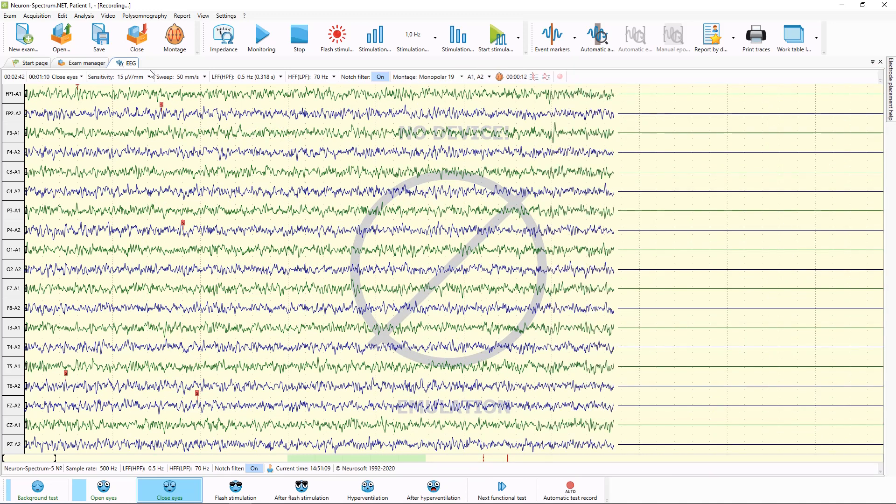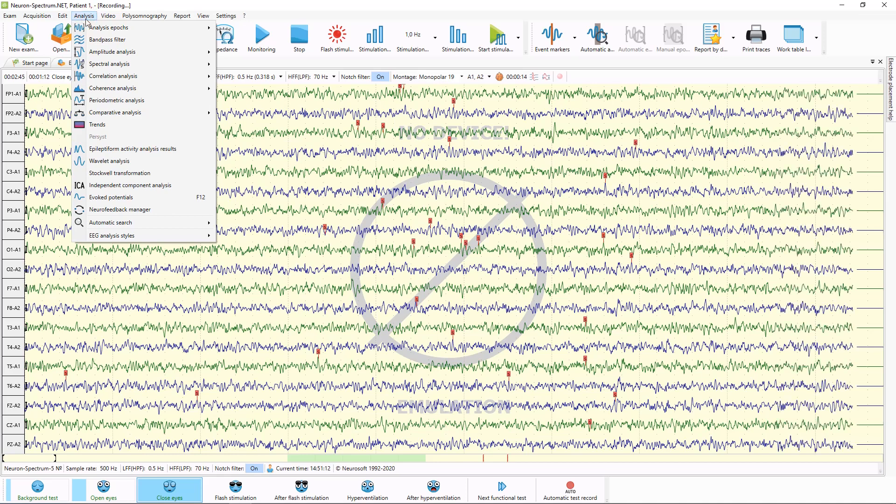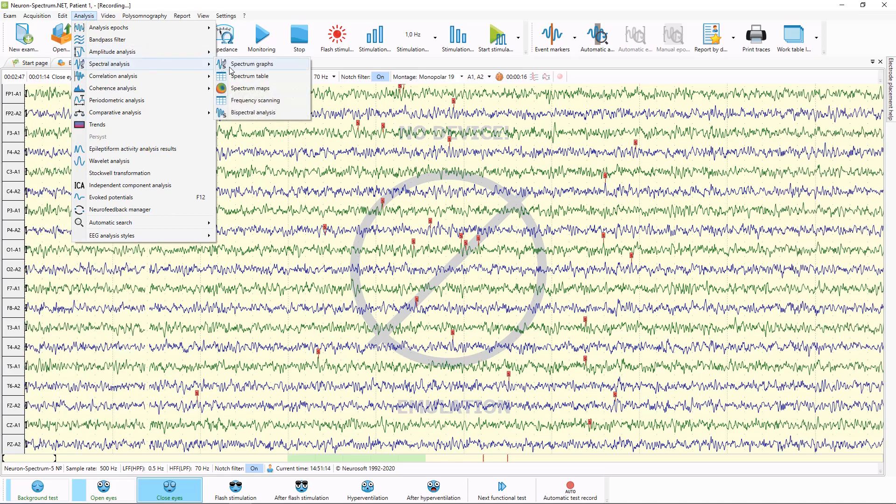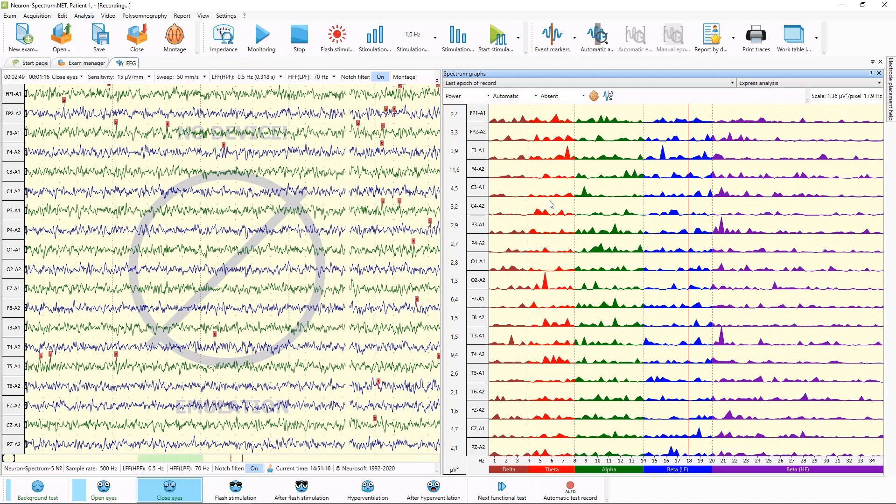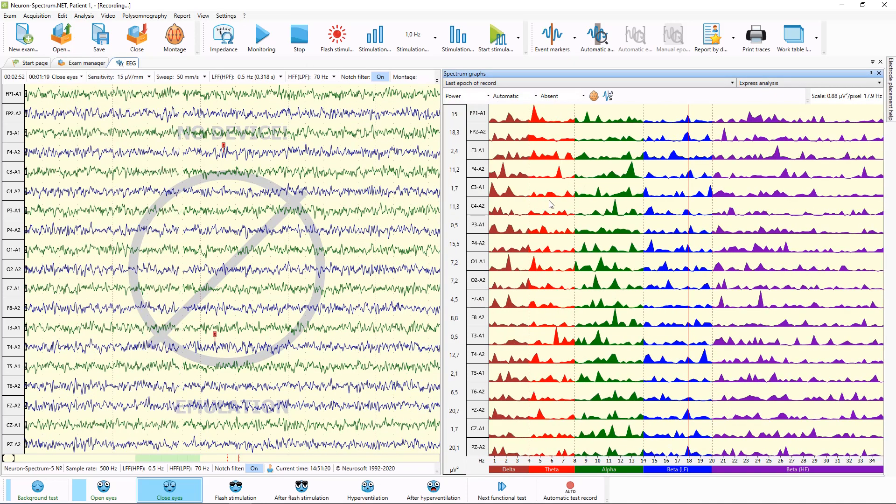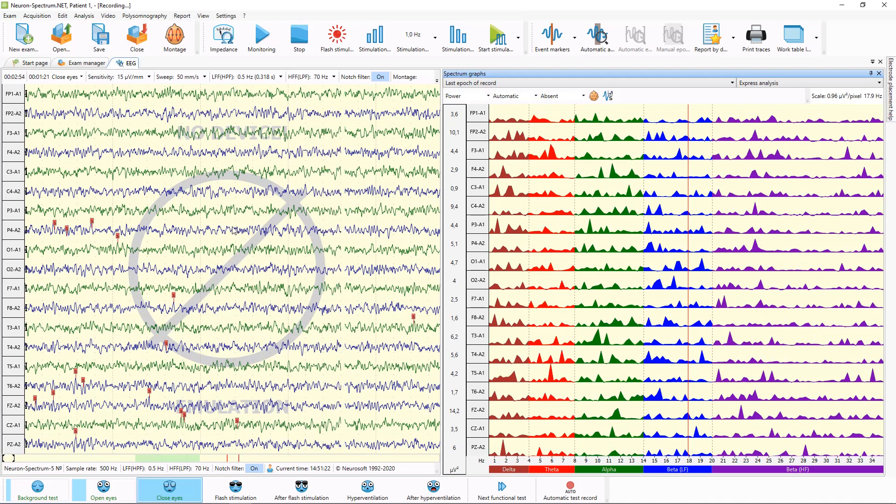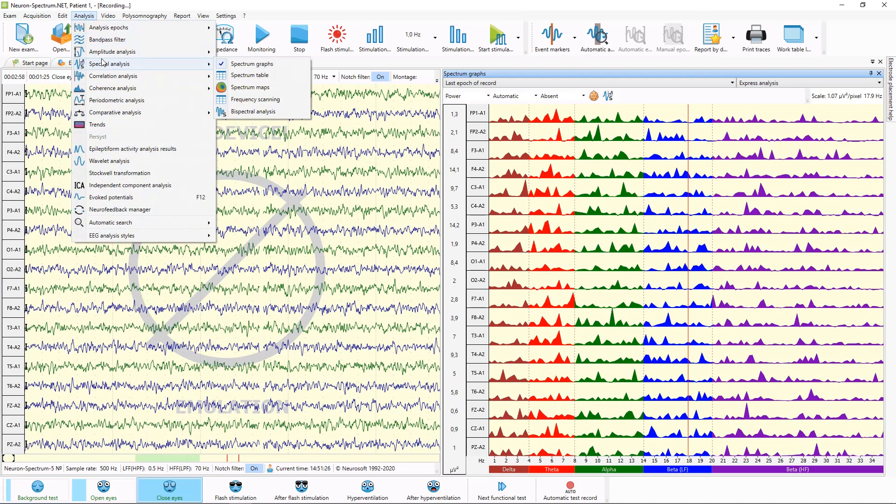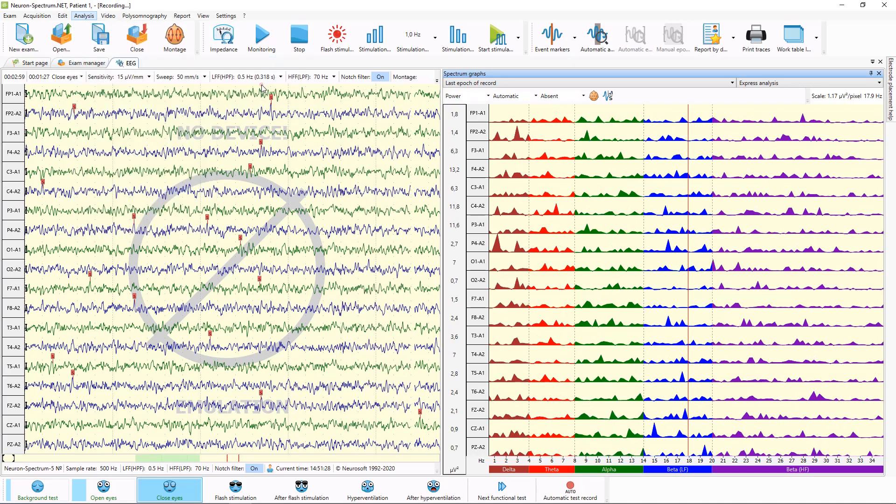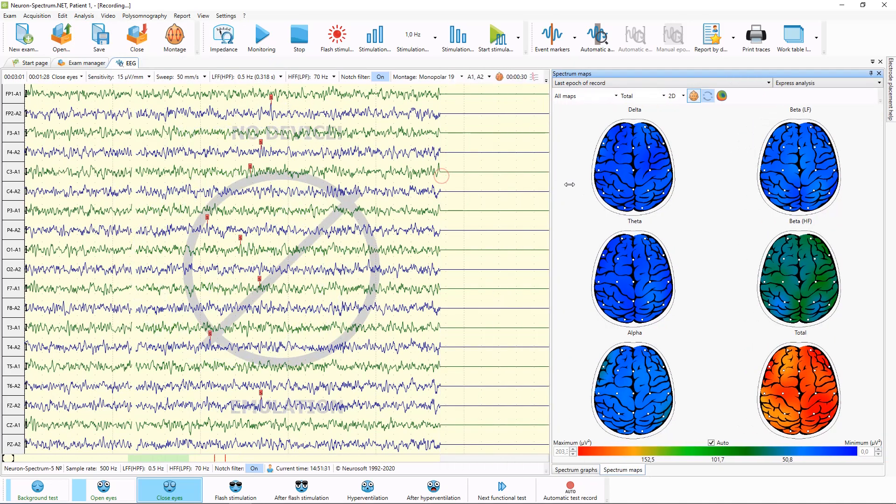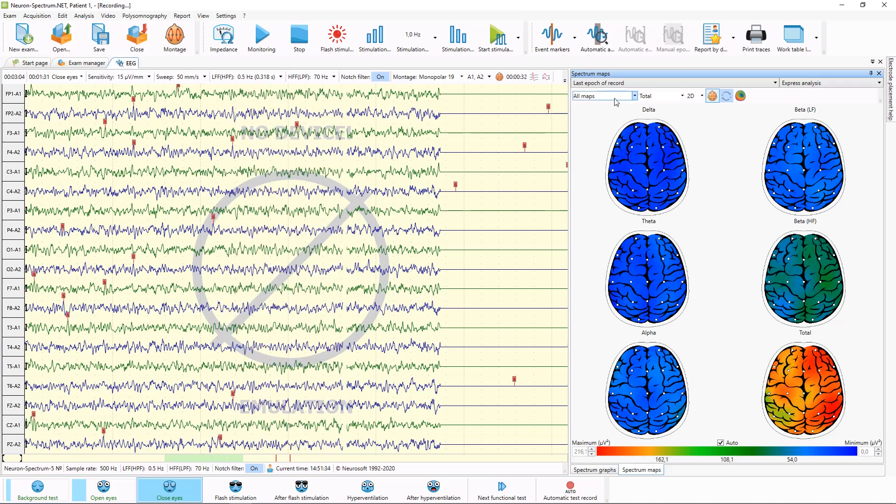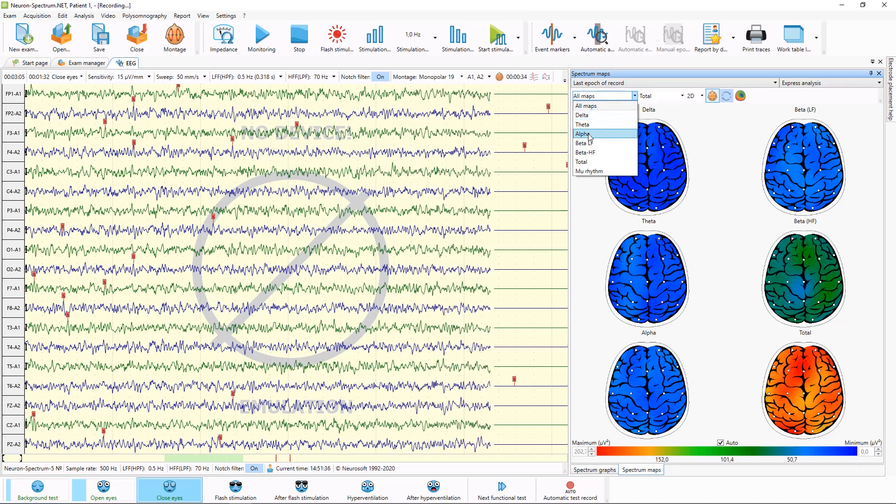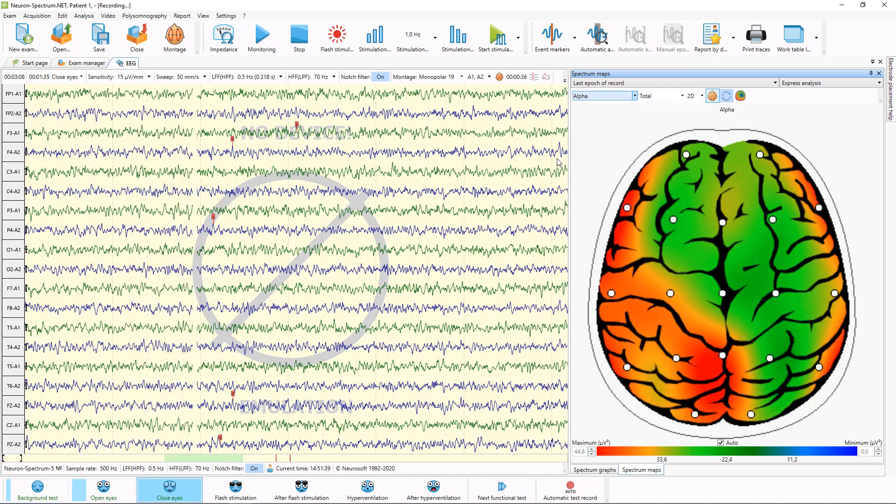Also during acquisition you can use different analysis tools. For example, you can use spectral graphs window, where you will see the spectral results of acquisition. Or you can use, for example, spectral maps. Select rhythm, for example, alpha rhythm.